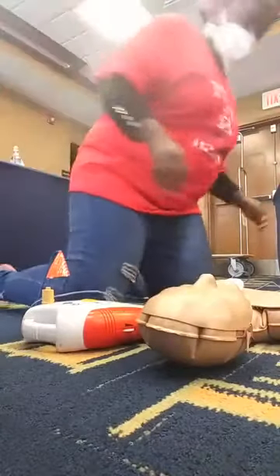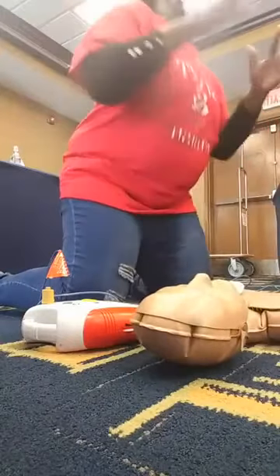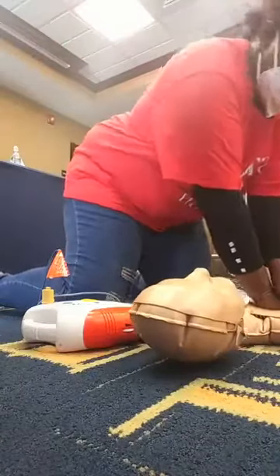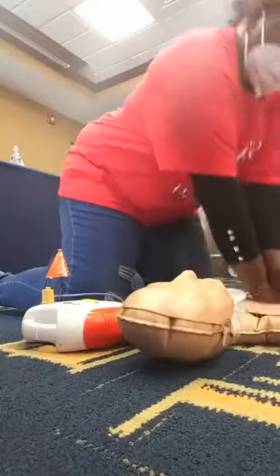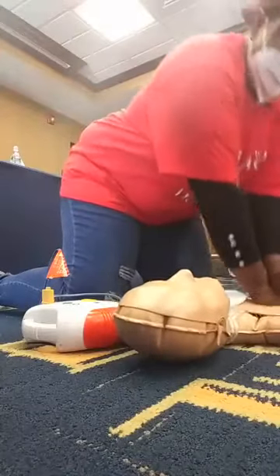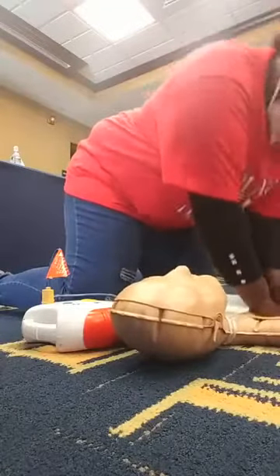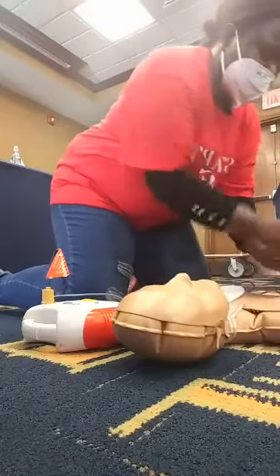And resume compressions. That beep that you hear right there, that's the rate that you're supposed to do the compressions. Or you can think about the Stayin' Alive song. 2, 3, 4, 5, 6, 7, 8, 9, 30. The other person's going to be giving 2 breaths. 30 seconds of CPR remain.